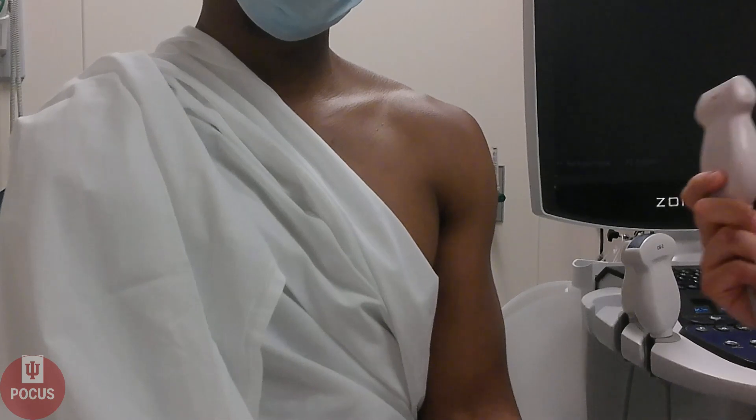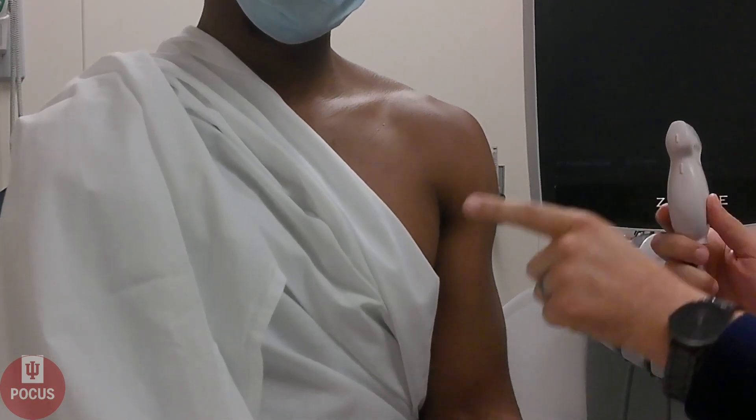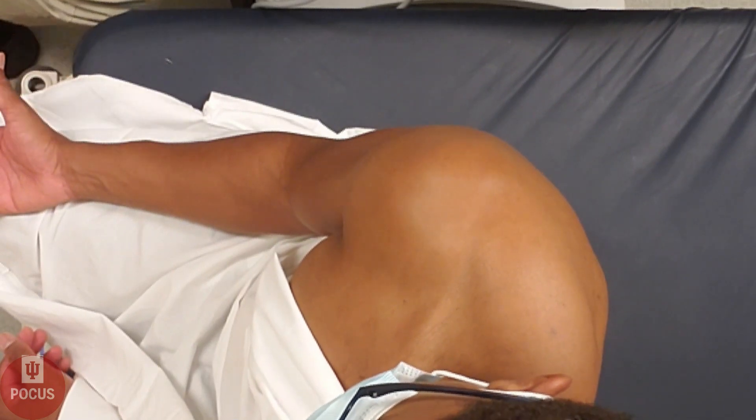First, we will position our probe so that the marker dot is pointed towards the patient's right or towards their head. We'll have the patient place their hand palm up on their knee.